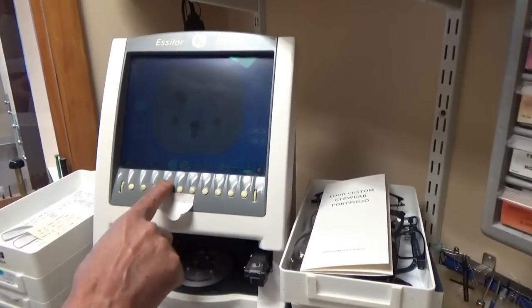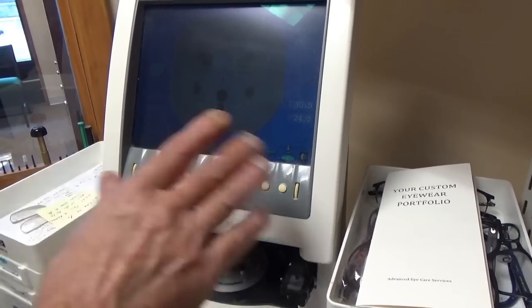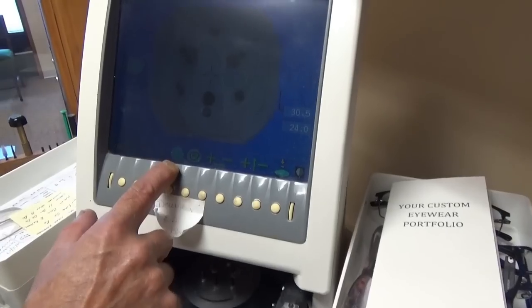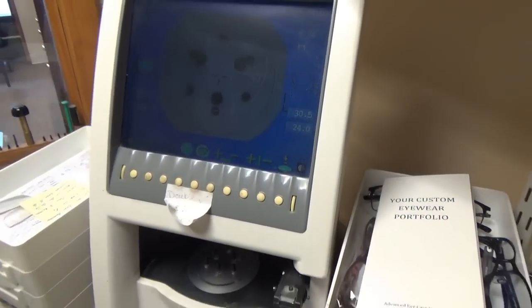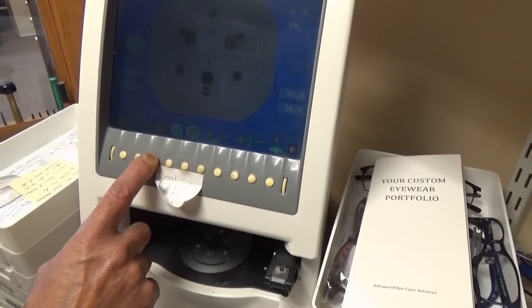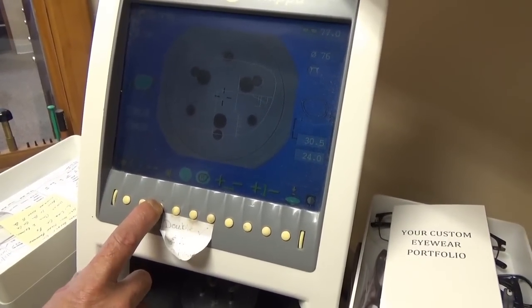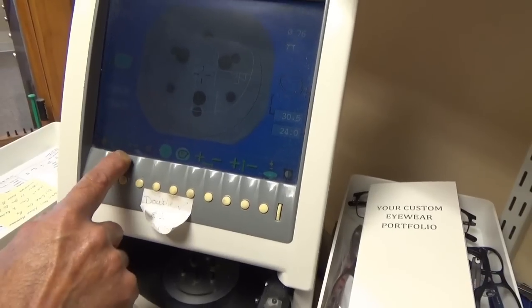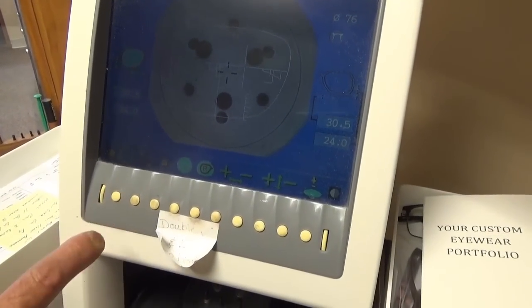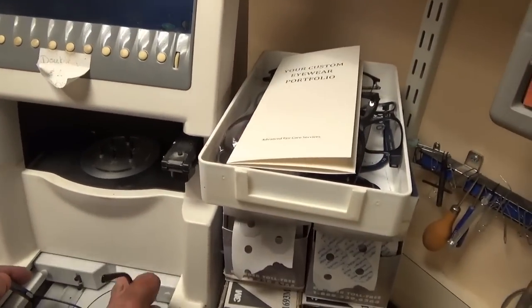We'll put that up on the machine. These are different settings: this would be like an invisible bifocal, an executive — which you don't do much — or just a single vision lens. This shows your bifocal setting. This tells you what the frame is: plastic frame, a different type of plastic, specialty metal, or traditional metal. We have right and left — we can do right only, left only, or both separately.